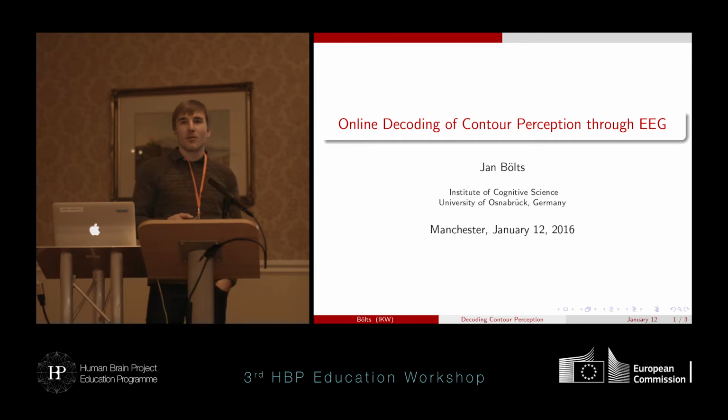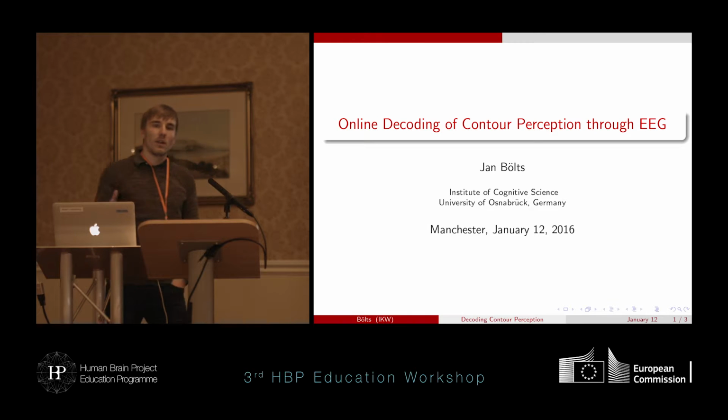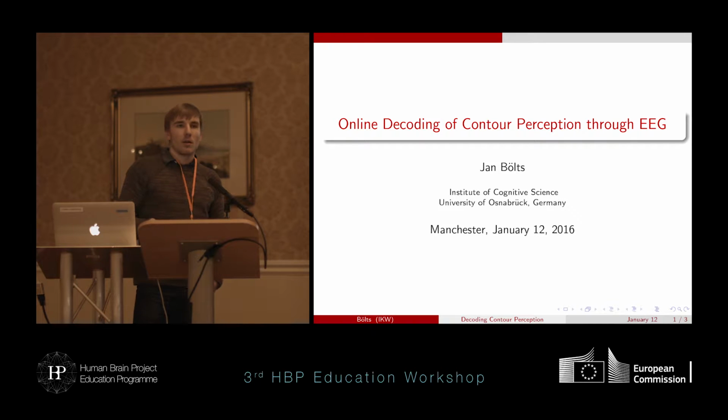decoding. So the fact that every piece of information that enters our senses is encoded into brain activity makes it possible to decode this activity and to decode the sensory information that entered the brain. So now we can take EEG data and decode sensory information from the data.